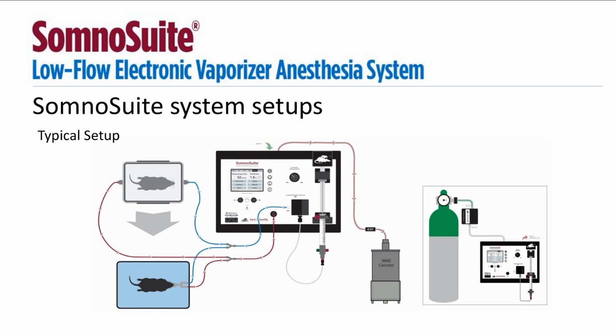Okay, so in this blue line, this is our inspiration line. It'll come from the vapor block and will split into two branches, each leading to the induction chamber as well as the face mask. From there, the expiration line here in red will come from the induction chamber as well as the face mask and lead to the expiration line passively until it reaches the WAG canister.